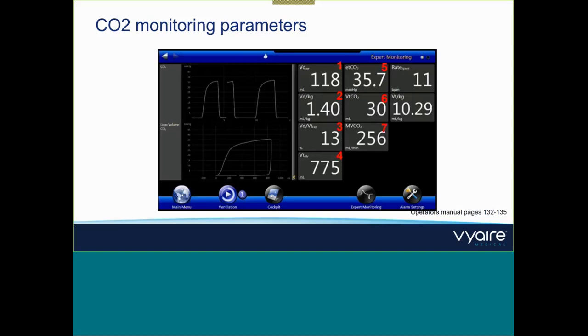And we also have the other ones which are not directly related to CO2, but you see we have 7 values, which makes it very easy to understand the metabolism of the patient and also to optimize the ventilation. But for today, the ETCO2 is the most important, and this is what we're talking about today. But that's so that you're a bit prepared for the next capnography webinar, where we talk about the other volumetric values.